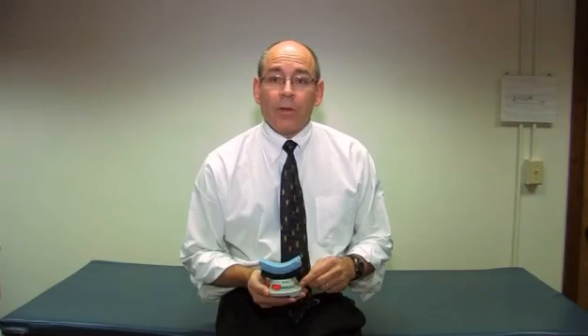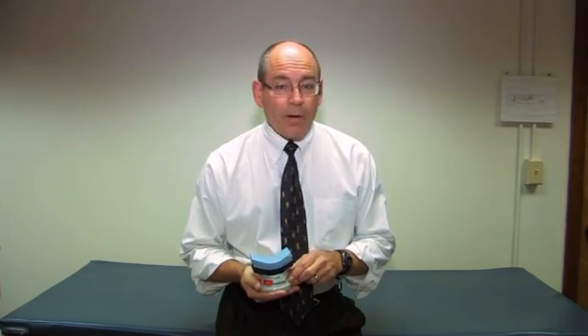Today we're going to be talking about handheld dynamometry. This is a handheld dynamometer, actually a MicroFET by Hogan Health Industries. We need to make certain that a handheld dynamometer like this is not the same as a hand-grip dynamometer. A handheld dynamometer is held in the hand of the examiner and applied against the individual being tested, whereas a hand-grip dynamometer is held in the hand of the person being tested to determine how strong their grip is.